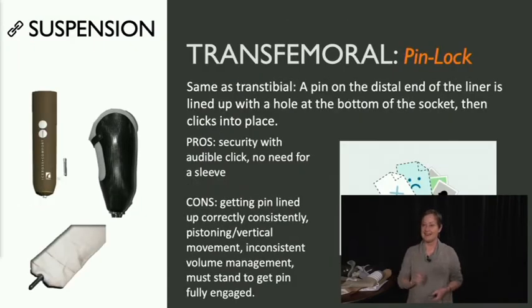Okay, pin lock. You might notice on this slide that we say we can't find your file, and that's because our company rarely does a pin lock for a transfem patient. So we didn't really have any people available to take pictures of. That said, there's a new system. You might see a separate presentation about the Connect TF system, which is a different kind of socket, and it does use a pin for a transfem patient. Otherwise, we really don't do it.